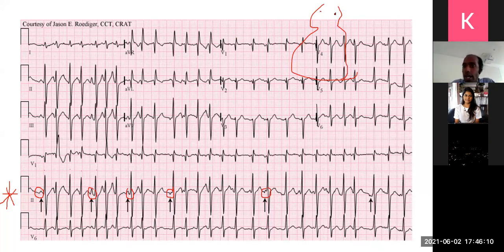Right. So essentially you have the atrium there. This is the sinus node here. What is happening is the atrium is firing at 3 or 4 places. And that's why it's giving 3 different P wave morphologies. So abnormal P waves, with different P wave morphologies.